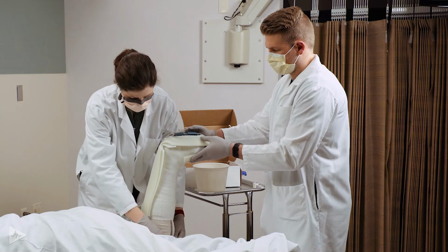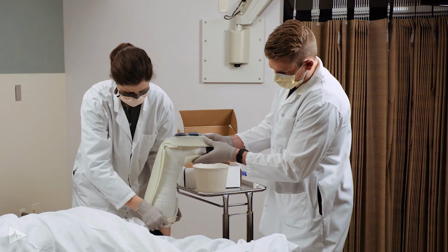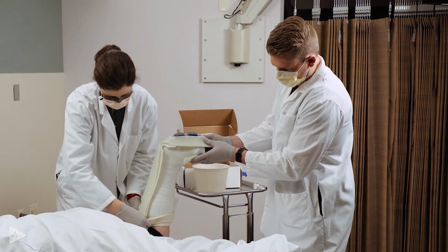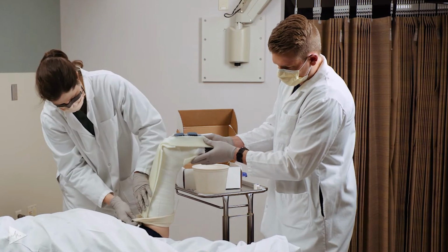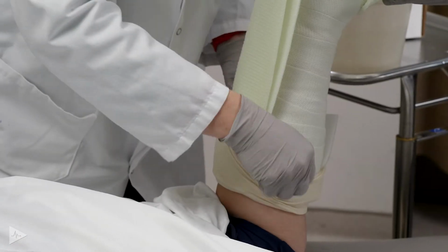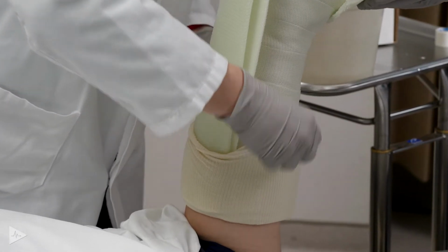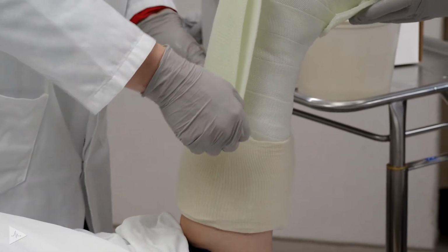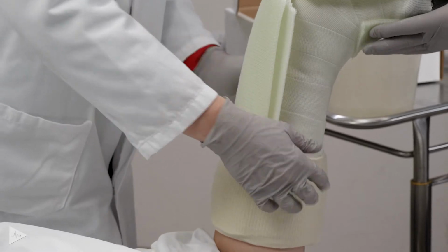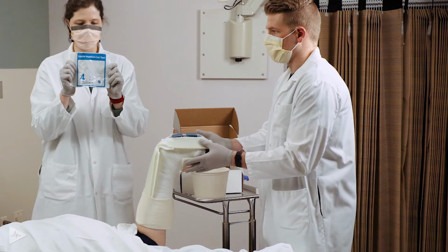Then we will take that excess stockinette and padding and roll this over the top of the cast, sealing in those underlayers. Make sure that fiberglass splint lays flush. And then you'll have your final piece, which is the 4-inch fiberglass roll.